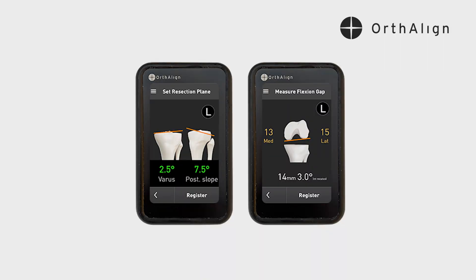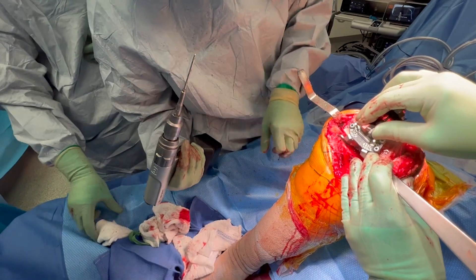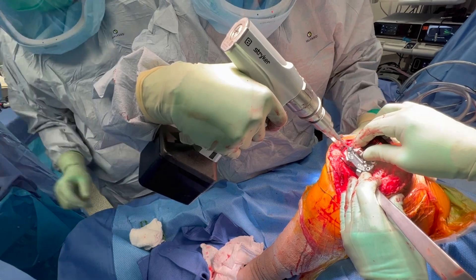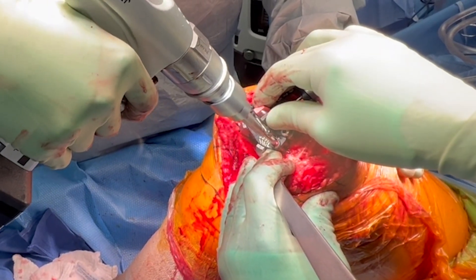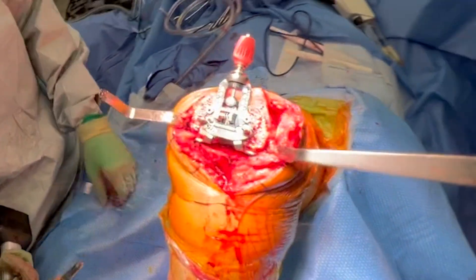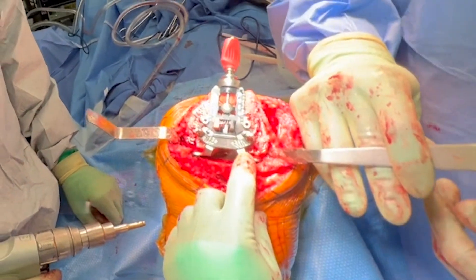Moving to the flexion gap, we're a little bit looser on the lateral side, so I'm going to externally rotate it a little bit. In my experience, for every two millimeters looser lateral, you're going to have to externally rotate by one to one-and-a-half degrees to close that down. I'm pinning our rotational guide at right in between zero and three degrees — which is one-and-a-half degrees of external rotation — then going ahead and making all of those distal femoral cuts.